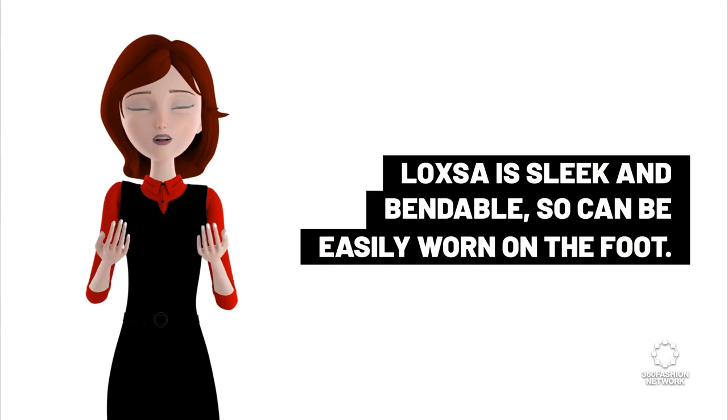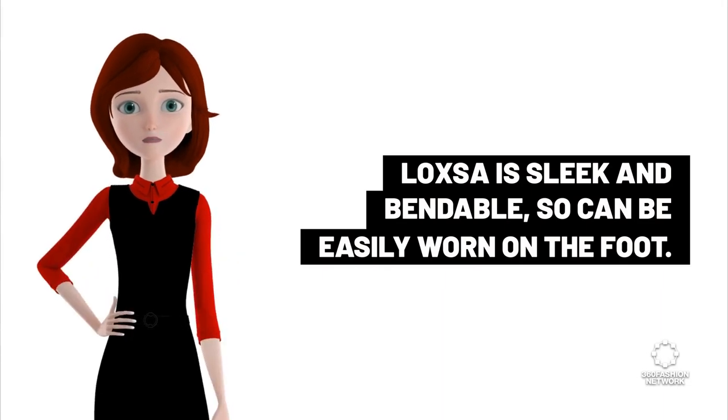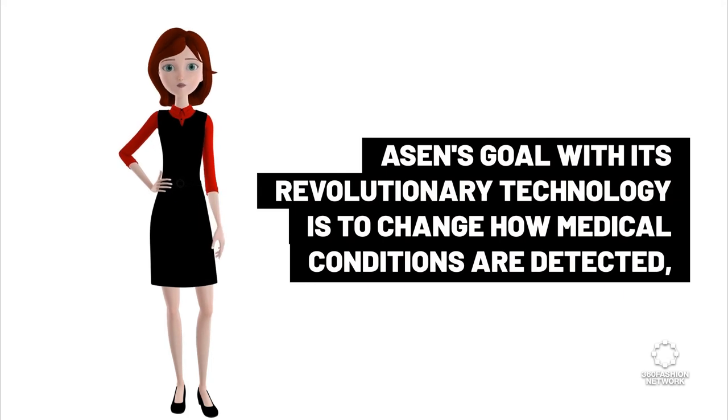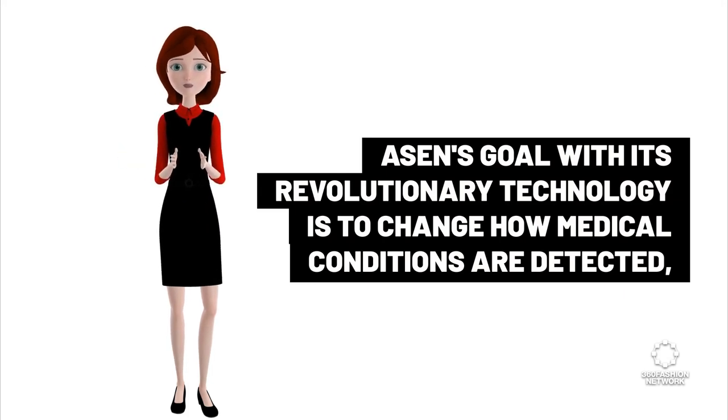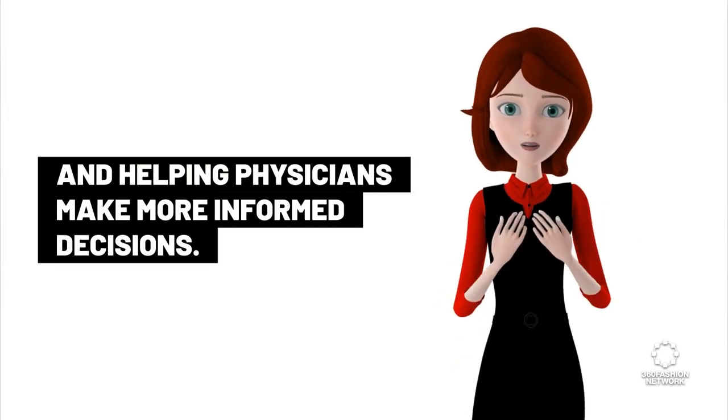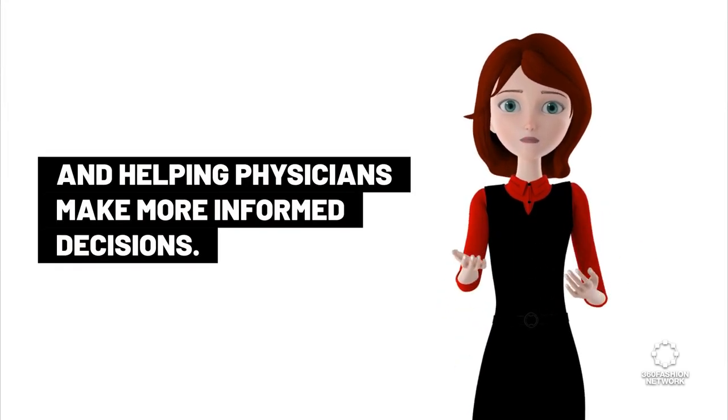LOXSA is sleek and bendable, so can be easily worn on the foot. ASEN's goal with its revolutionary technology is to change how medical conditions are detected, monitored, and treated, improving health outcomes in patients and helping physicians make more informed decisions.